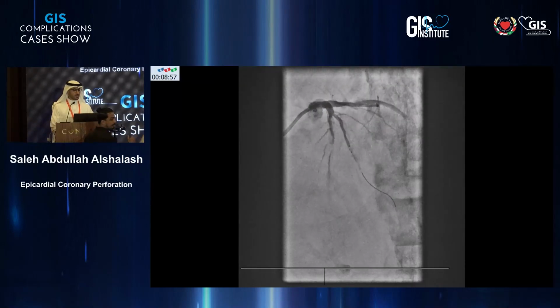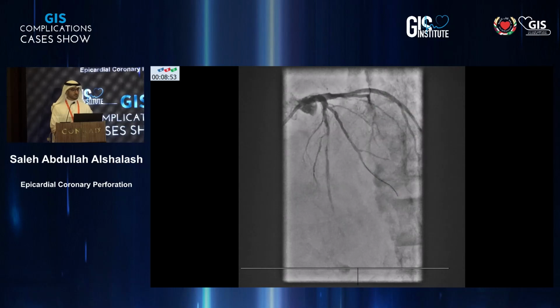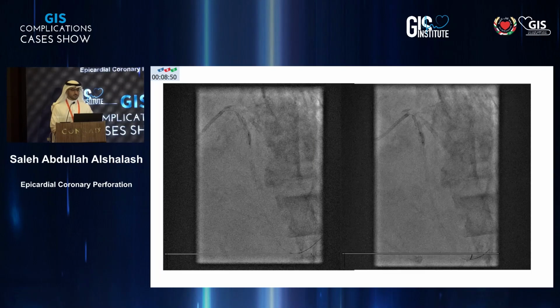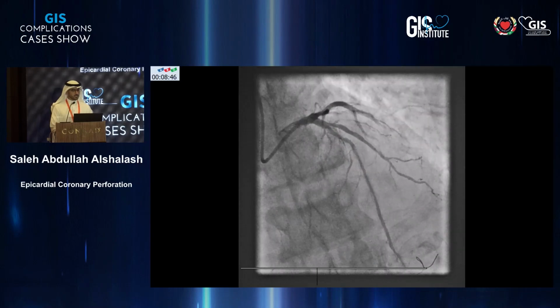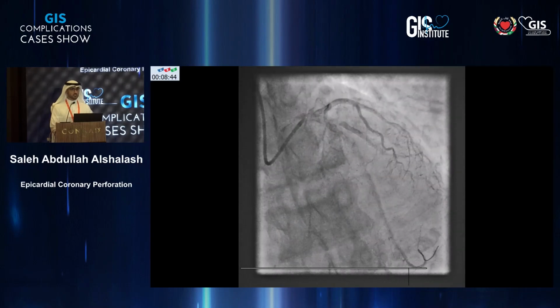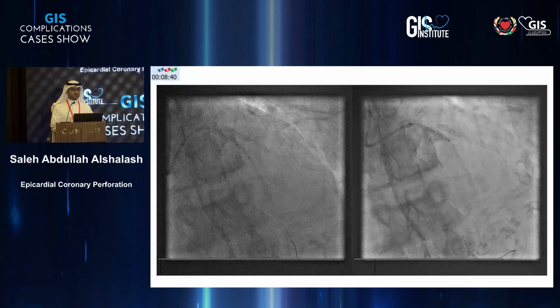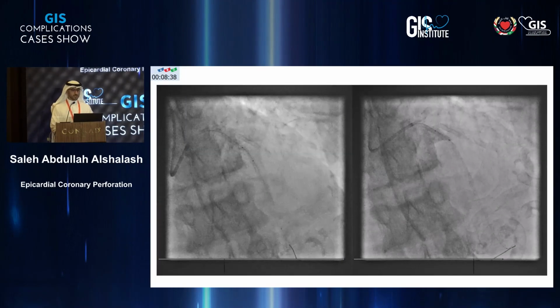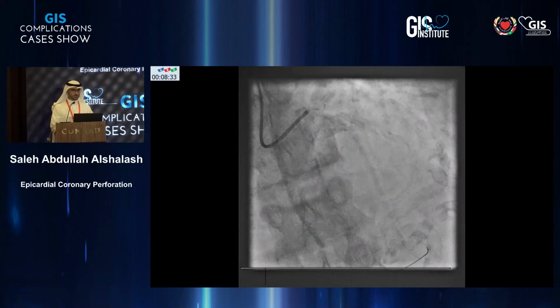So we started with the diagonal. We ballooned it. It responded fairly well to the balloon. Stented, got good results. Started ballooning the LAD, ballooning, and ballooning. Fairly good expansion, so really surprisingly better than expected results with just the balloons. Kept ballooning and ballooning. LAD so far, so good.